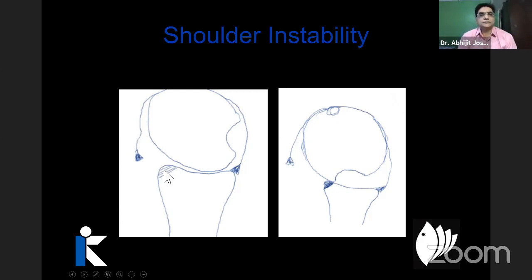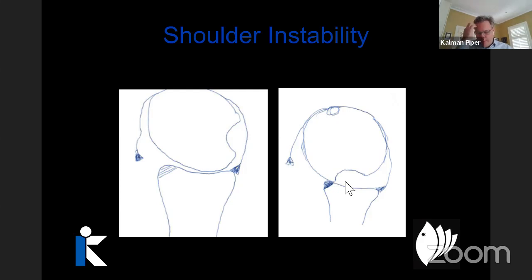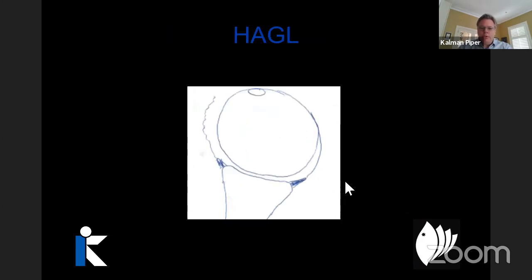Great. So even if you lose a small amount of bone off the anterior rim of the glenoid, this Hill-Sachs fracture will engage at a much earlier stage, and therefore you have a problem of bone pathology getting in the way, which may interfere with a standard soft tissue repair. And when I see these combined Hill-Sachs and glenoid rim fractures, I'm already starting to strongly lean towards performing a Latarjet procedure as opposed to a soft tissue procedure. Also, capsular defects and HAGL tears can also be managed with a Latarjet procedure as well.